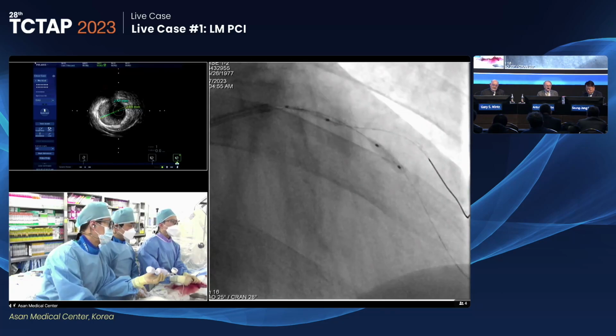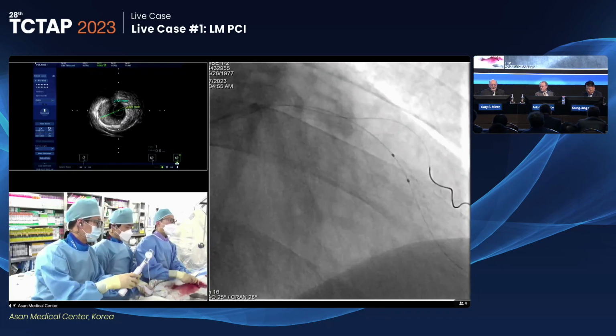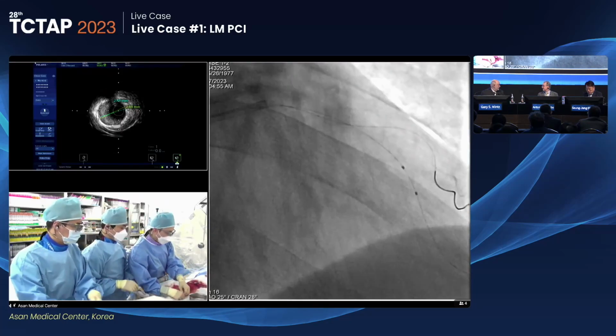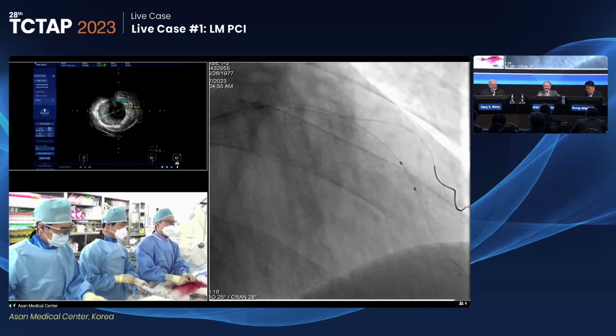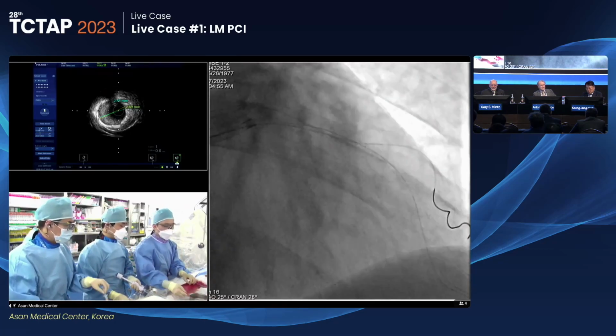Any stent. Difficulty. Yeah, we have a problem delivering there, so this means some undilated ostial area, so a better preparation there would be good. Whether you leave it after that or not is up to you. It's optional, the stenting. Yep. Yes, I agree. The only way to prevent restenosis is not to be able to deliver the stent.